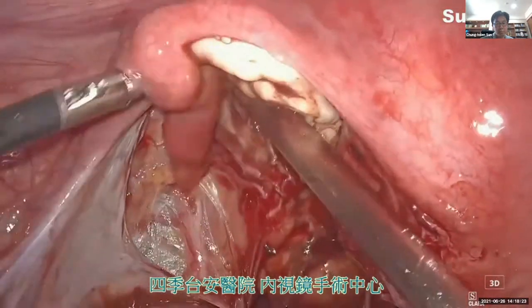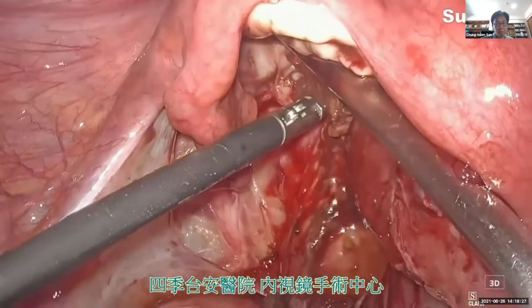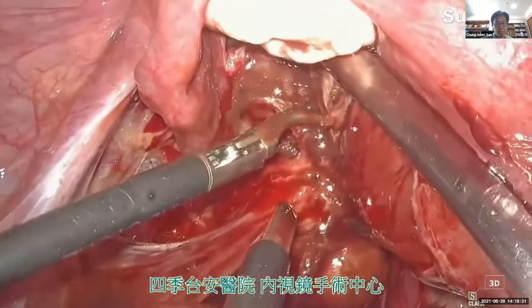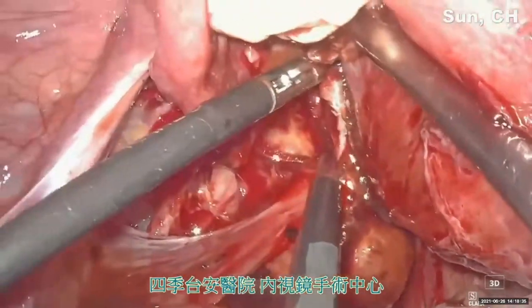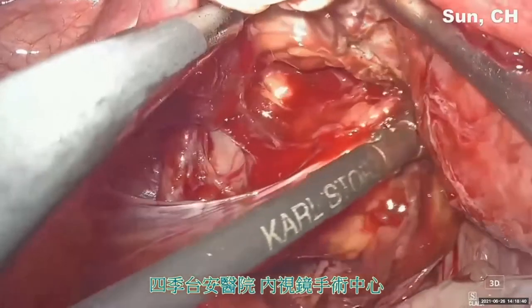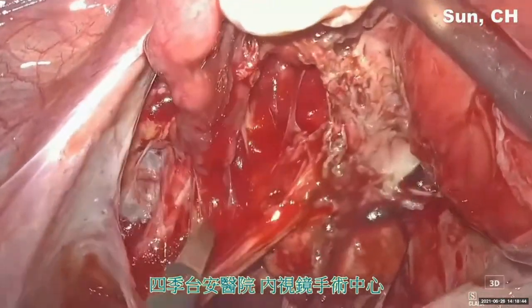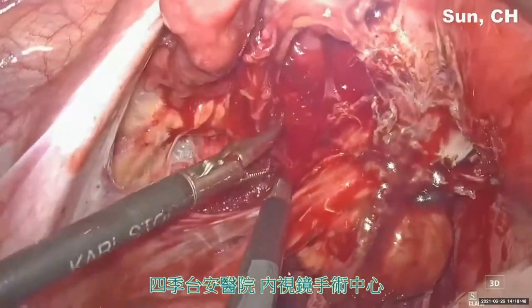And the second most important reason is because if we want to maximally preserve the ovarian tissue, we don't want to avulse some ovarian tissue along with the peritoneum. We don't want to sacrifice any ovarian tissues. So, okay, this is what I will call a step one procedure, dissect the ovarian fossa.